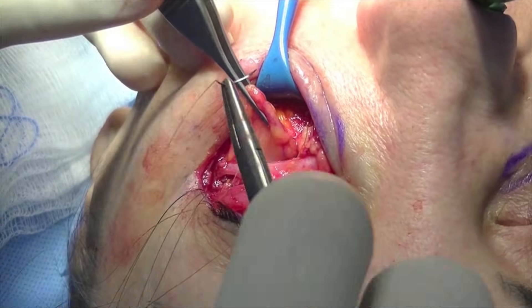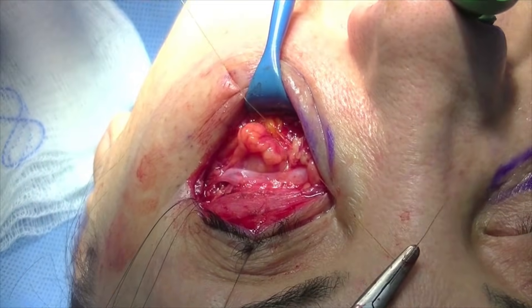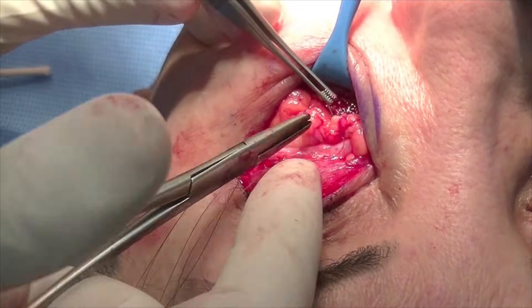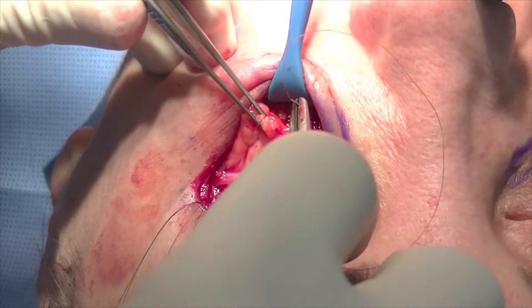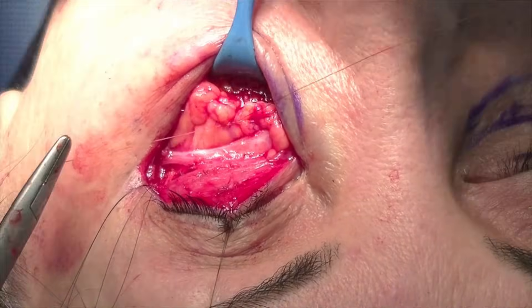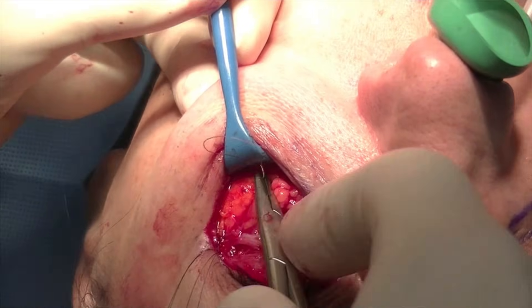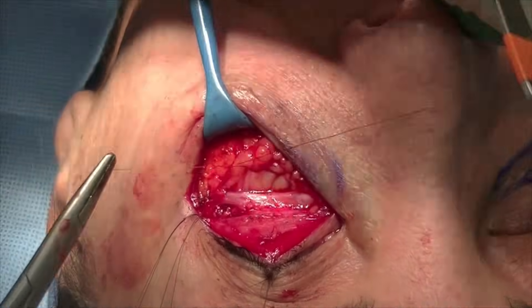This is the central fat pad now being transposed. Another advantage of this open technique is that we can sculpt the fat, placing sutures between the medial and central fat compartments to create a more confluent fat volumization along the entire infraorbital rim. We can also sculpt it medially and laterally with additional sutures, as we see the central fat compartment being re-draped further laterally.